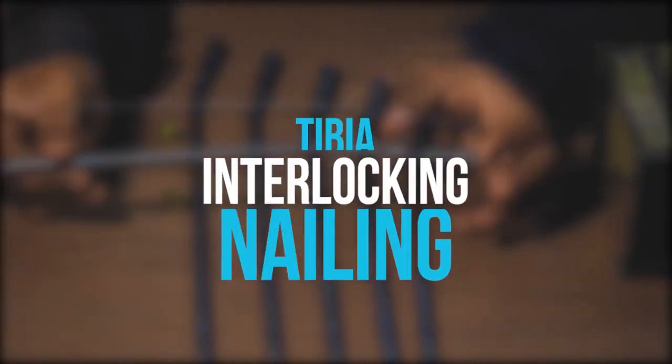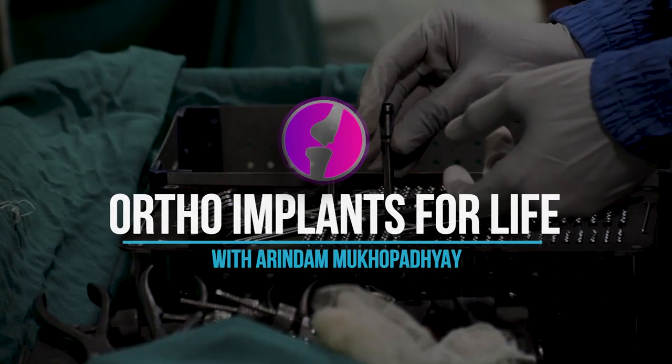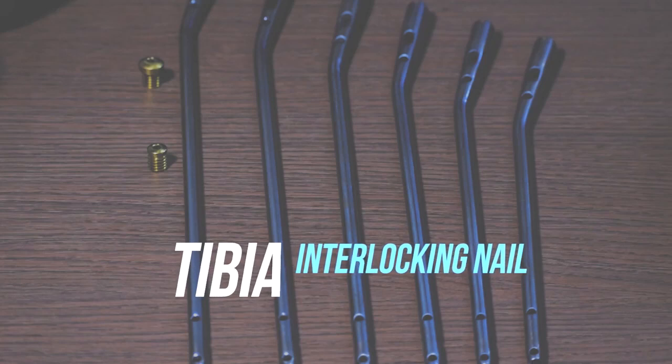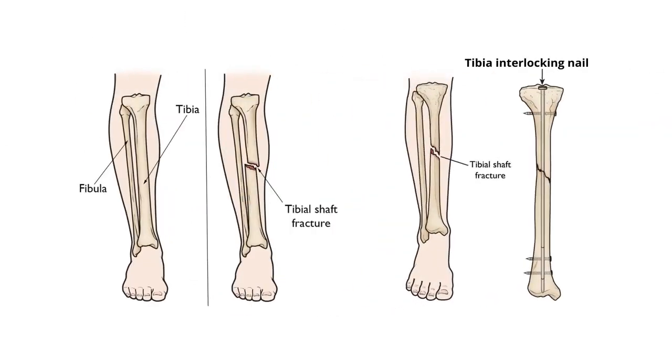Hello friends, welcome to Ortho Implants for Life. Today we will discuss about the tibia interlocking nailing system — the implants, instruments, and fractures it can help fix. This tibia interlocking nailing system is basically used in tibia shaft fractures.